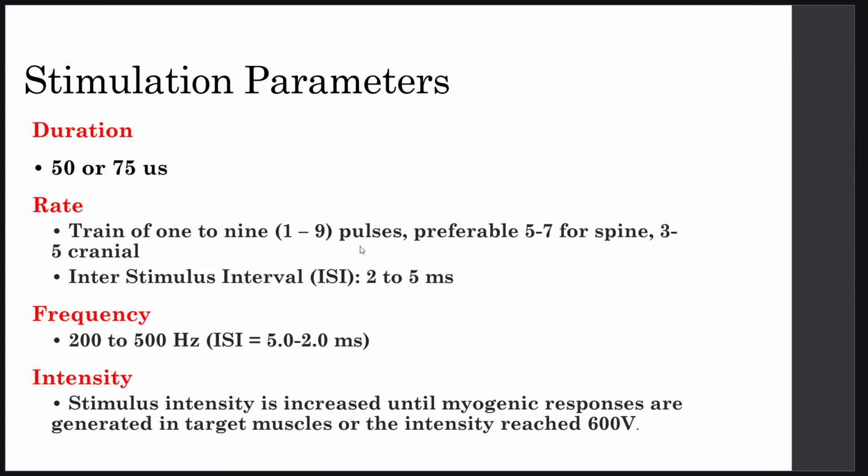Because the patient is anesthetized, we use train stimulation, which is multiple stimulation, for the motor evoked potential. When you give 5 pulses, the time between stimulus 1 and stimulus 2, and stimulus 2 and stimulus 3, this is the frequency of stimulation. Okay, while the 1 hertz or 2 hertz you see on the device is not the frequency of stimulation. It is the rate of your train. And if stimulation 1 and stimulation 2 have more time between them, we say that has a long interstimulus interval, so it is a lower frequency.